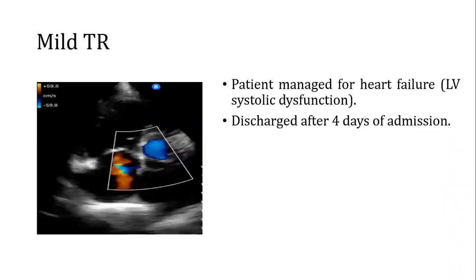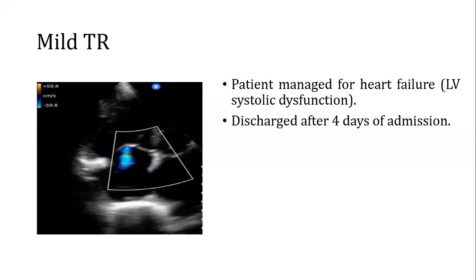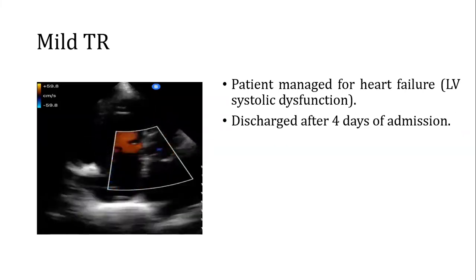Yes, like we saw, the IVC is not collapsing. There was also tricuspid regurgitation. We know where there is regurgitation. Thankfully, this was not so severe. The regurgitation was not so severe.